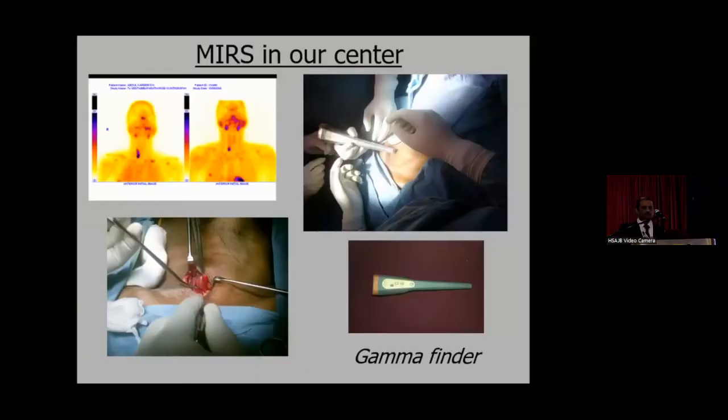How it is done? So this is an interesting person. He is a 27-year-old male who is a television actor. He gives a history of hemithyroidectomy 10 years before, at the age of 17 itself. And now he has all the typical symptoms of hyperparathyroidism, bone pain, and now a sestamibi scan clearly shows that there is a recurrence of the lesion, that is in the right inferior parathyroid adenoma. Possibly he had a left hemithyroidectomy.